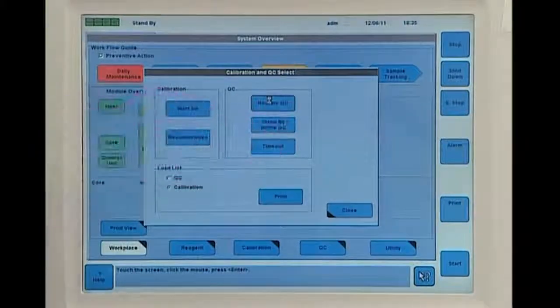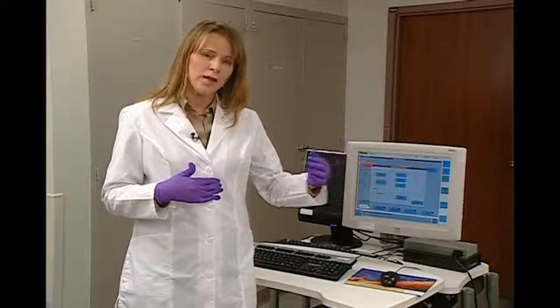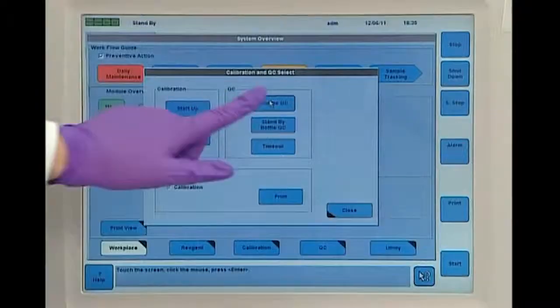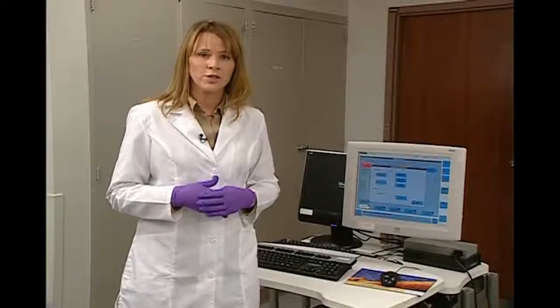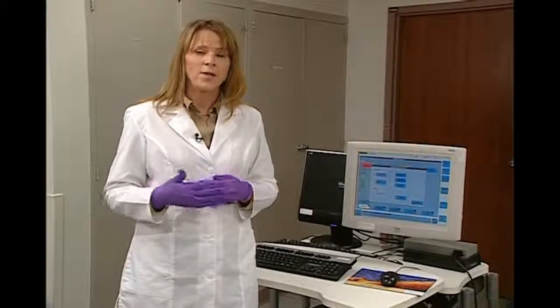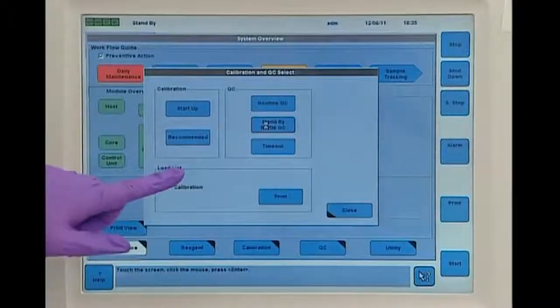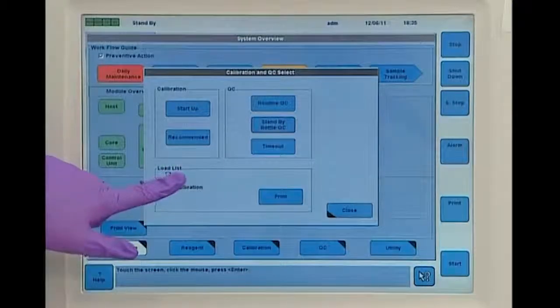In this screen, we can also order our QC. We can select the routine QC button, which is going to order QC on our entire platform for all the packs that we're currently using. And we can also press the standby bottle QC. And this is going to order QC on all the standby bottles that we might have on. And we can also print the QC load list from this screen.